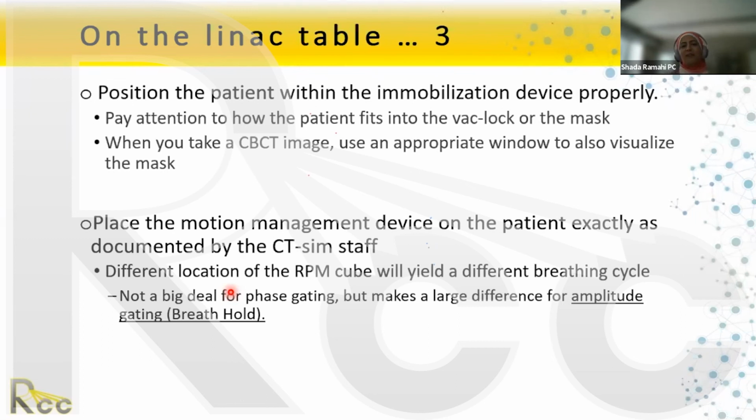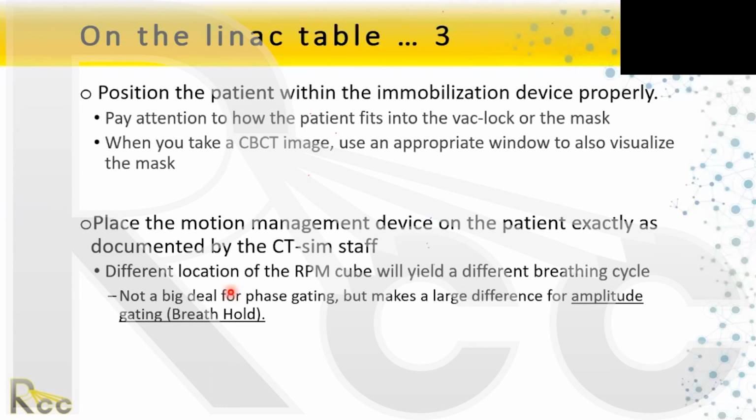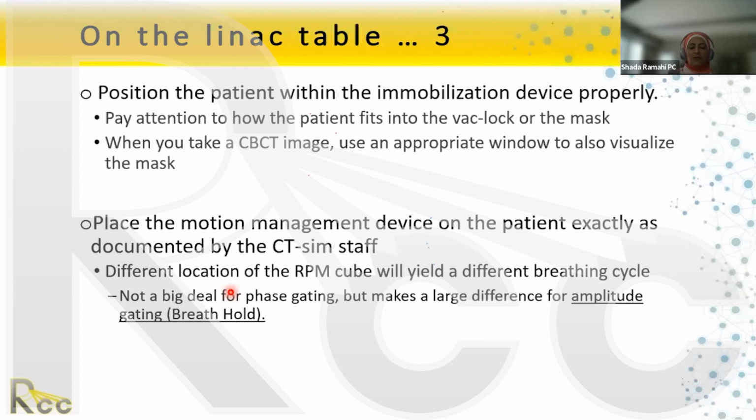Okay. It took them 6 CBCT images. No, this is good. For normal treatment, fractionation, for example 25 fractions or 30 fractions. And properly aligned. Positioning in the CT simulation is very important for all patients, honestly, but especially stereotactic patients, whether intracranial or extracranial, so that we spend a lot of time, or enough time, to ensure the patient is well immobilized and well aligned. These are 2 different things. Immobilization means the patient cannot move, whatever you put on them, straps tying the head. Alignment is the alignment on the table, or whether you have rotation. They are 2 different things, okay?